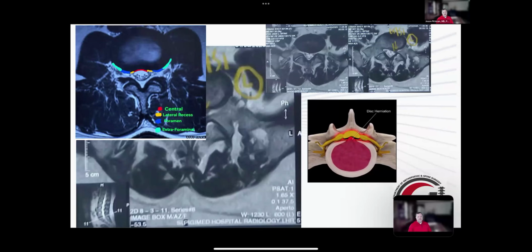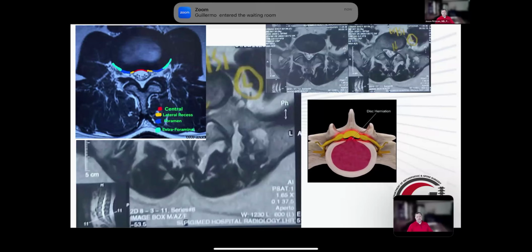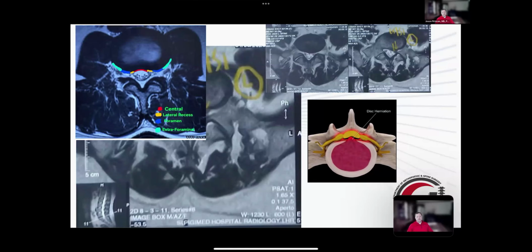And if you mess up your portal placement, the surgery becomes a nightmare. But if your portal placement is spot on, regardless of technique, the surgery becomes amazingly simple. But this is a great opportunity for biportal or uniportal to come interlaminar and likely over the top. So approach from the contralateral side, which will give you good access to the foramen.